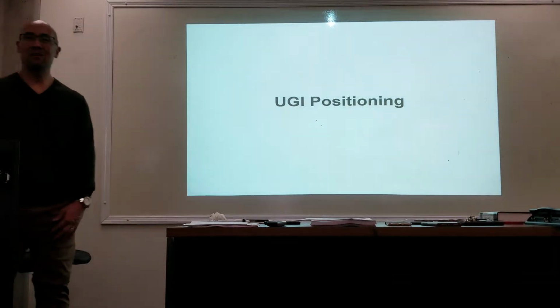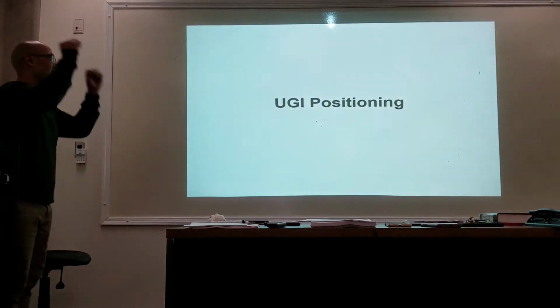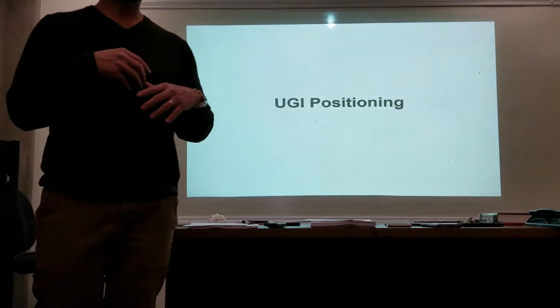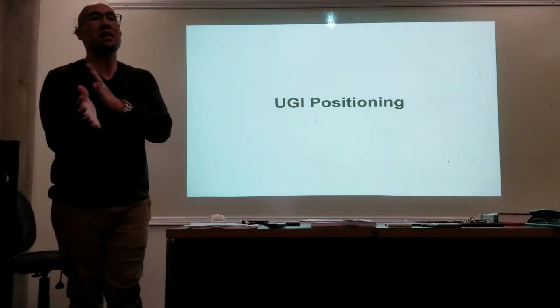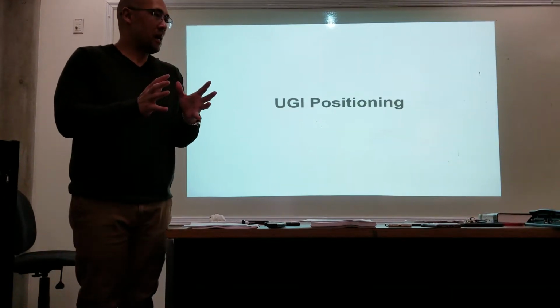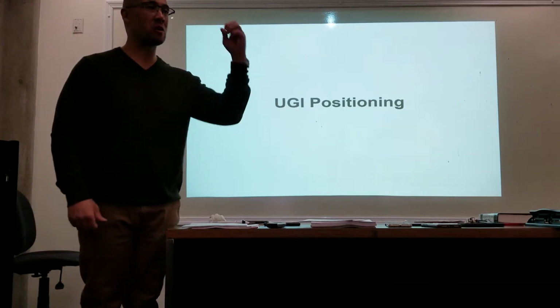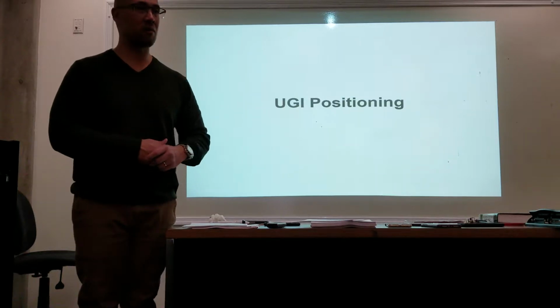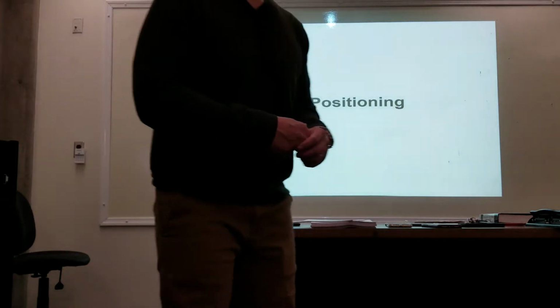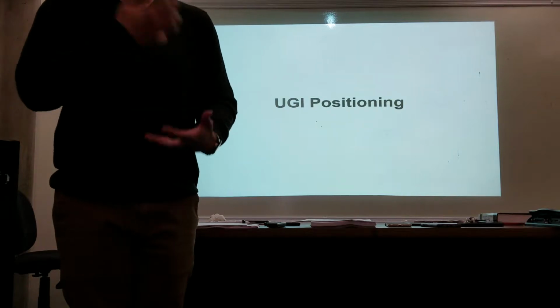All right. We're done with esophagram. Let's do upper GI. Now remember what I said. These procedures can be done separately, but sometimes they can be done as a grouping. It's very common when you're doing an upper GI, you're also looking at the esophagus and also the proximal part of the small bowel. Sometimes the doctor may order an upper GI and a small bowel, because it's continuous.